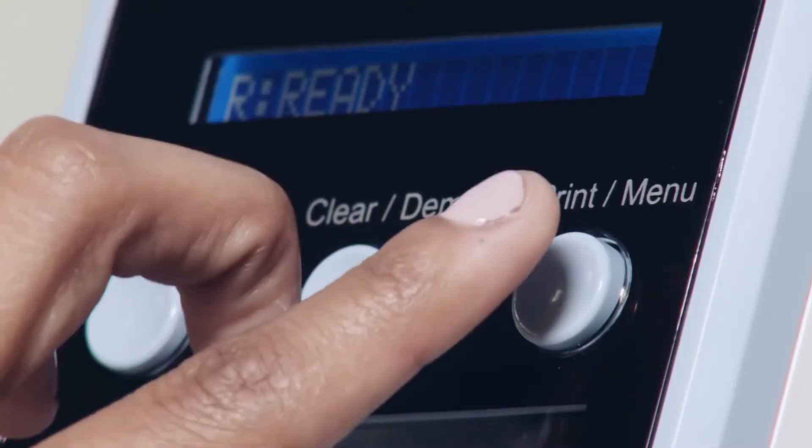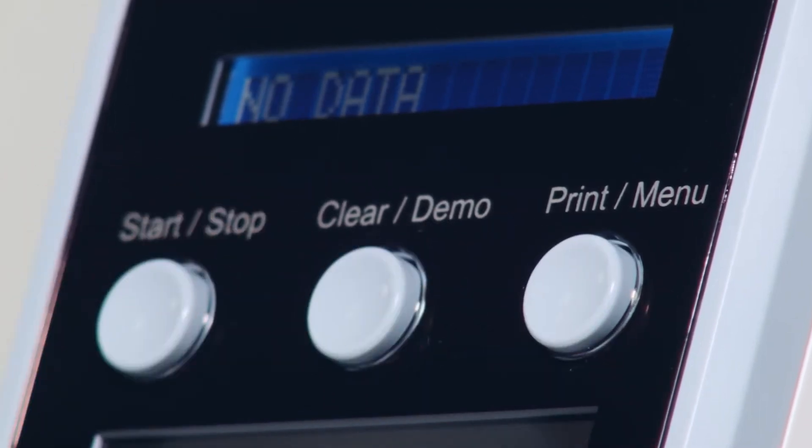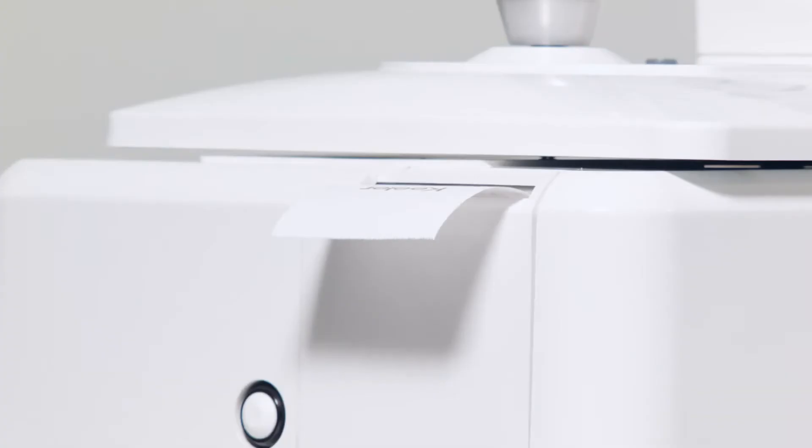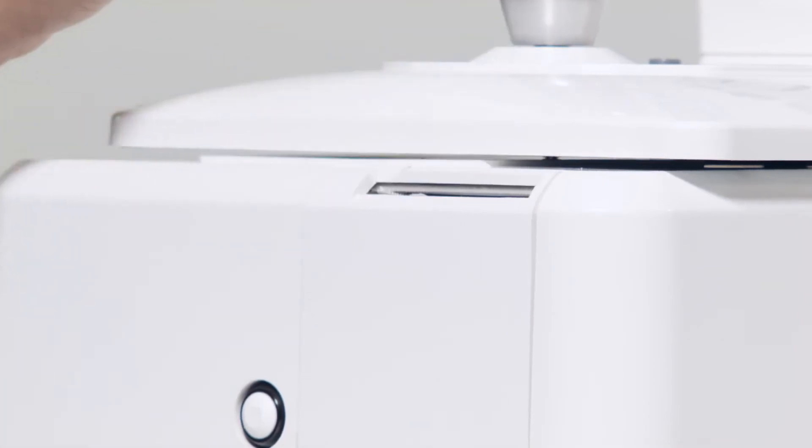Remain in the firing position until the PulseAir stops reading. The test results can be printed by pressing the print button. Data can also be sent as a flat file to a USB port.